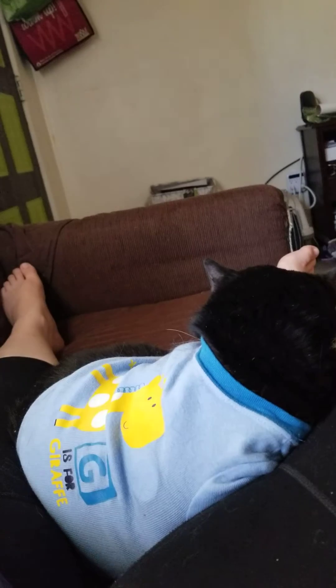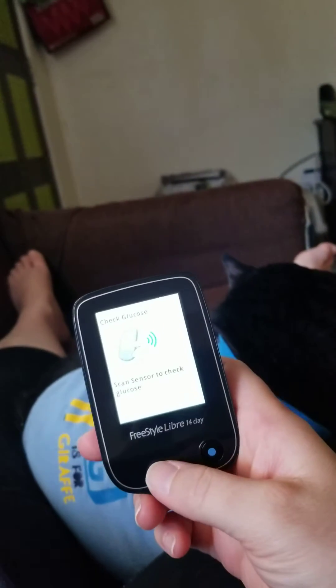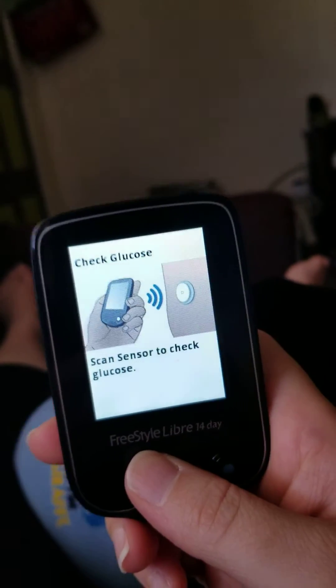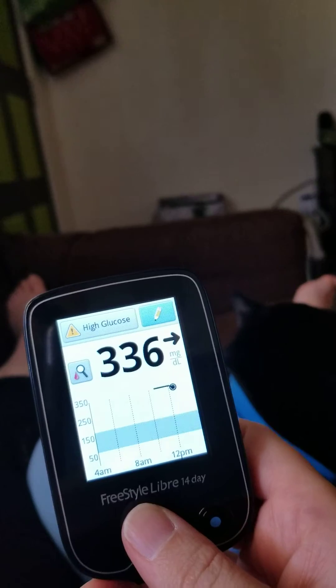But this is how I check his blood sugar. First up, I have a monitor — I'm going to turn this on. It just takes a little press of a button, and it says to scan your sensor to check. Just hold it near the sensor, it checks it — boom.